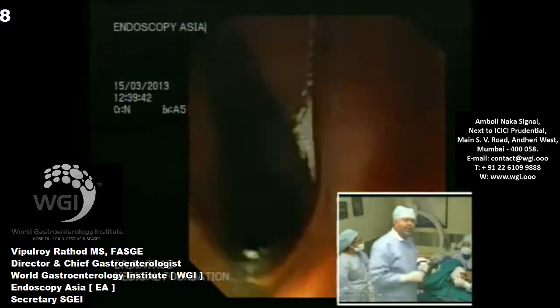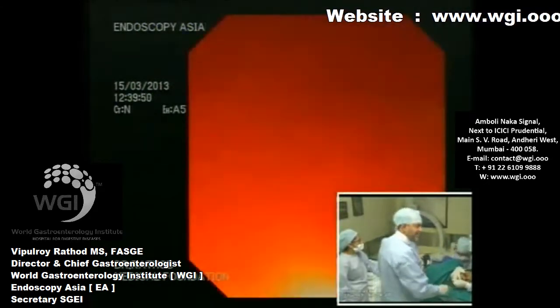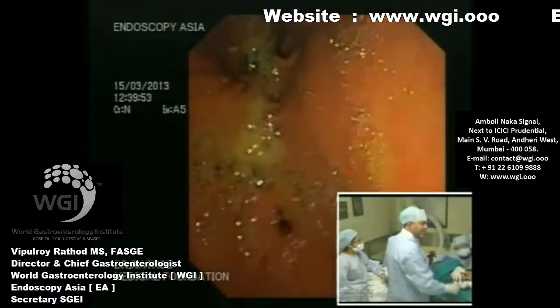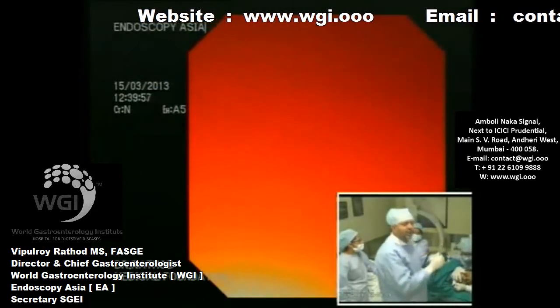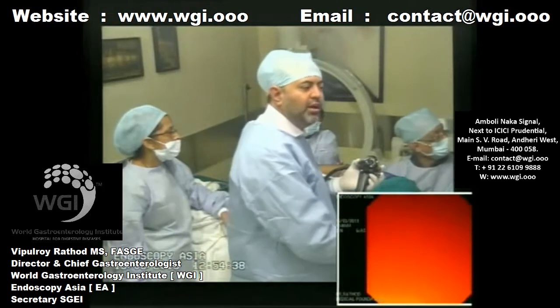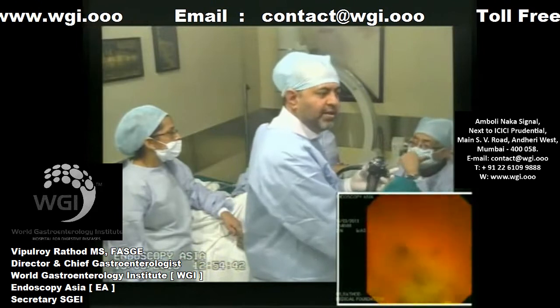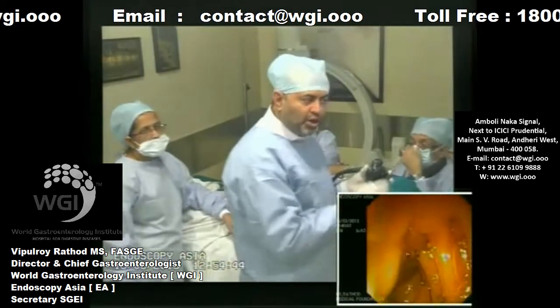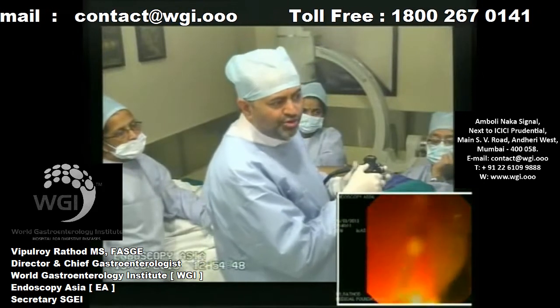So what we probably do is take an FNA from the head area, and FNA-B, we'll take a biopsy. We'll try and get a core biopsy. And we all know that core biopsy is what will diagnose autoimmune pancreatitis on cytology and histopathology, where we see a predominant lymphoplasmacytic infiltrate. And sometimes cytology is not good enough.